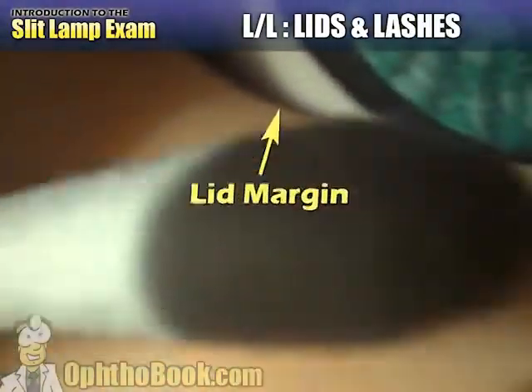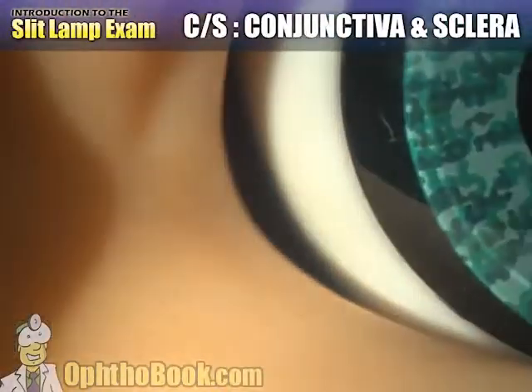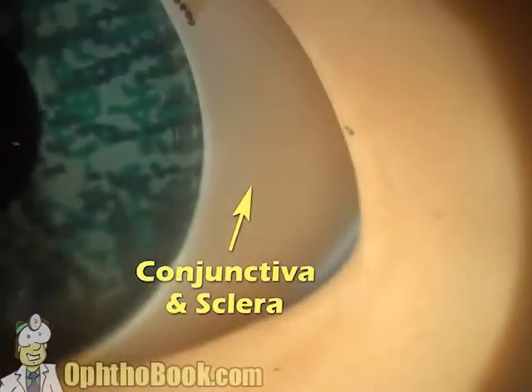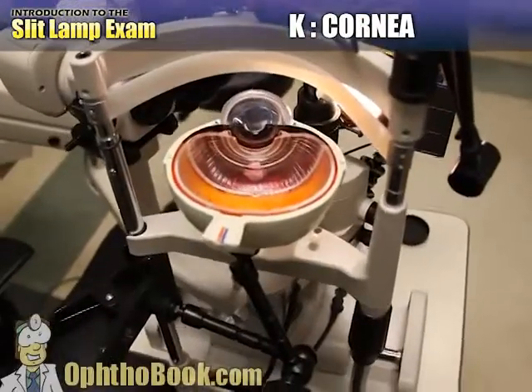Moving on to our lids and lashes, you always look at the lid margin, and you look at your lash line, of course, as well. Moving on to the conjunctiva and sclera, the white part of the eye, white and quiet here. We'll go over this in a little bit more detail in a bit. And then we move on to, of course, the cornea. Now, the cornea is that clear window in the front part of the eye.